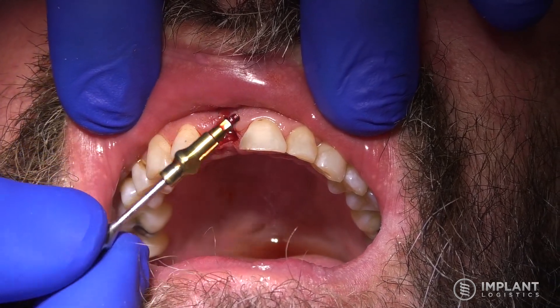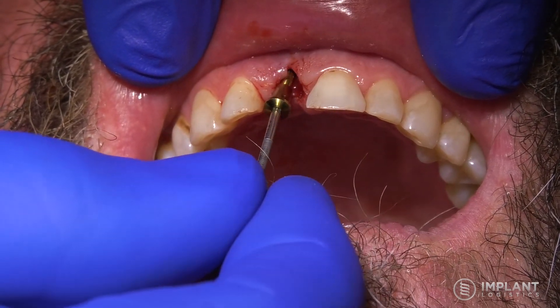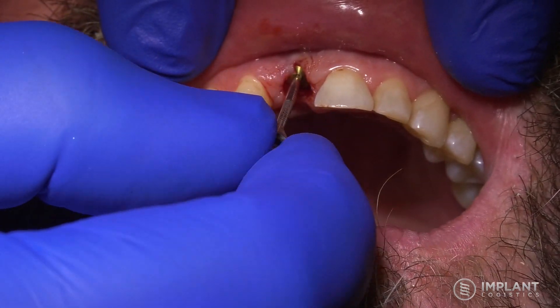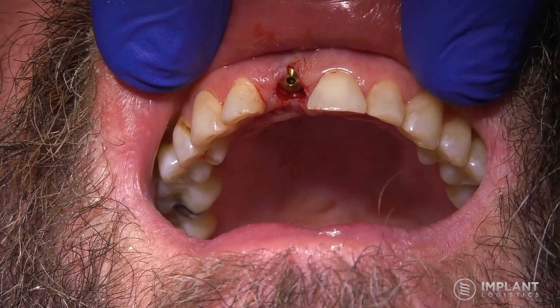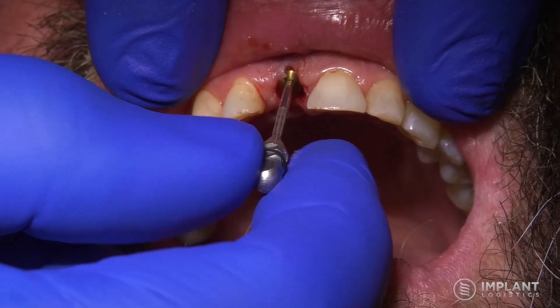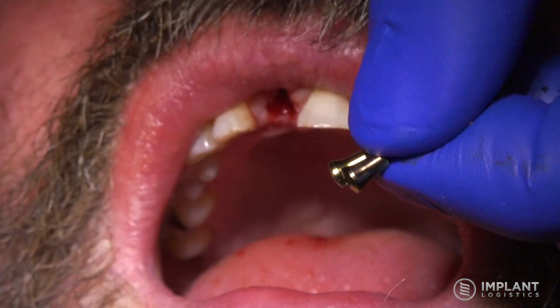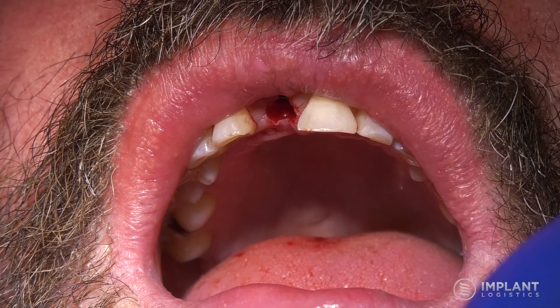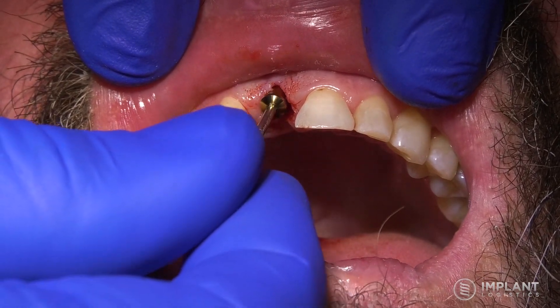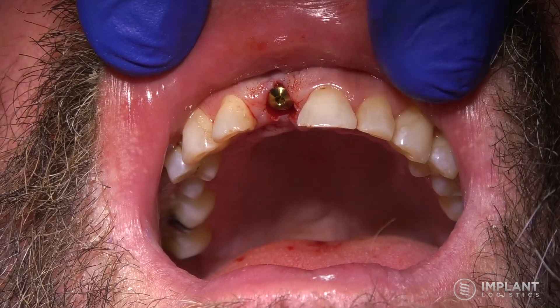Remove the impression post, and the next step will be to place a healing cap in that site. We're looking for a healing cap that would come up to about the top of the tissue, engaged in the implant. You can see this one is a bit short, so we'll replace it with a healing cap that's slightly taller. The tissue cuff heights come in different heights depending on the depth of the implant placed — pick the next size up and see if that fits more appropriately.